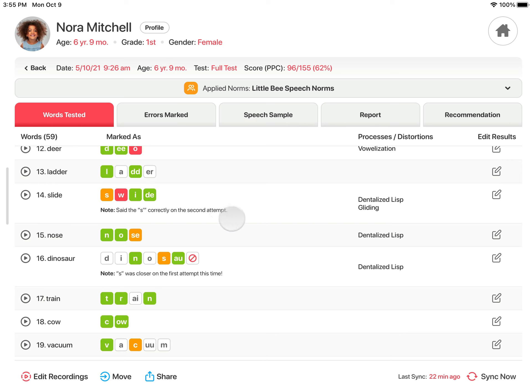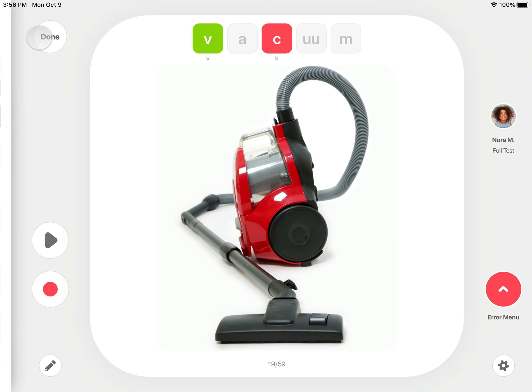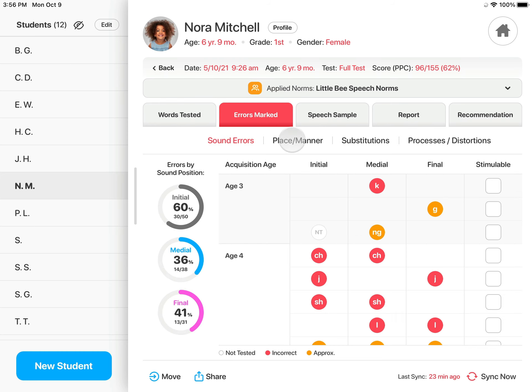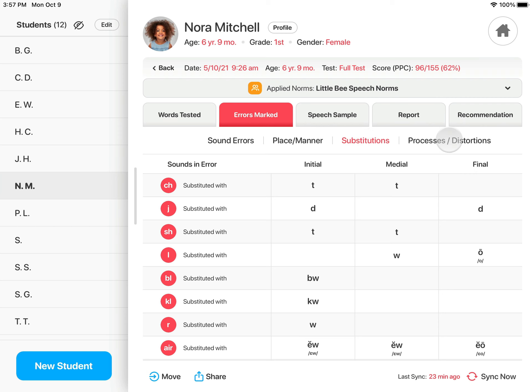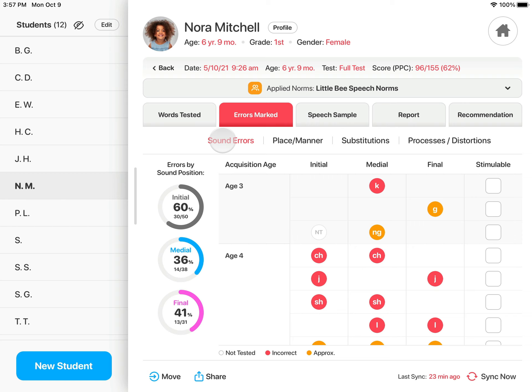If you would like to make changes, tap the Edit button next to the word you would like to update, and you will be taken directly back to that word in the test to make the change. Once you have made your change, tap Done to return to the test results. Errors marked are subdivided by sound errors, place and manner, substitutions, and processes and distortions.